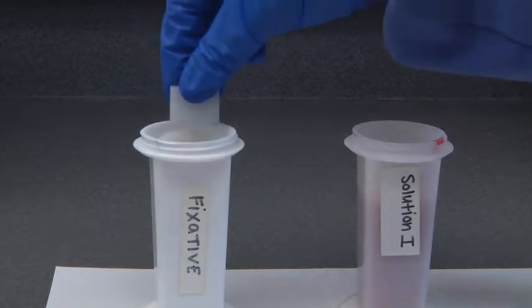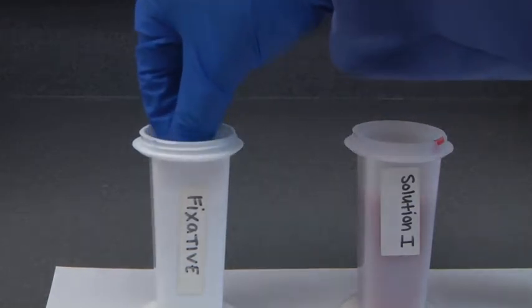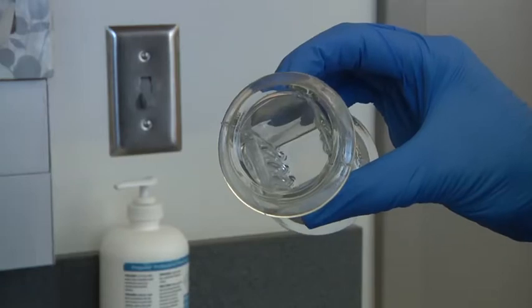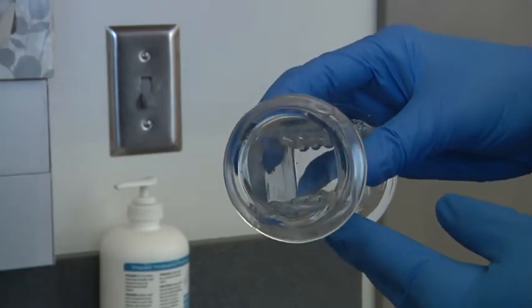The slide is then dipped in methanol to permanently adhere the smear to the glass slide. This process is known as fixing the smear. After dipping the slide, it is allowed to air dry. The next step is to dip the smear 5 times in the eosin solution.